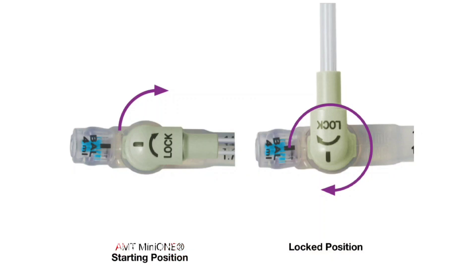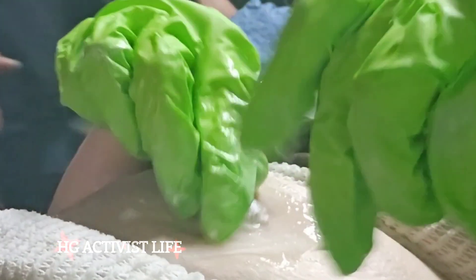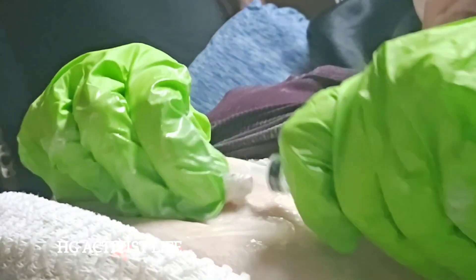This is showing you how to lock and unlock, connect, reconnect — the black line needs to go up to where the balloon is, going the same way, and then you turn it halfway.